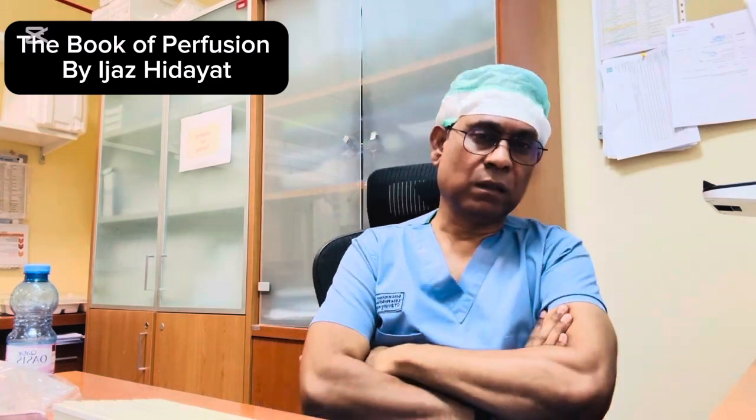Always keep 2 access cannulas, 2 return cannulas, so in case of any contamination, you have the alternative and the backup cannula available with your ECPR kit. Then try to design your own ECPR trolley, which is going to help you in case of emergencies.